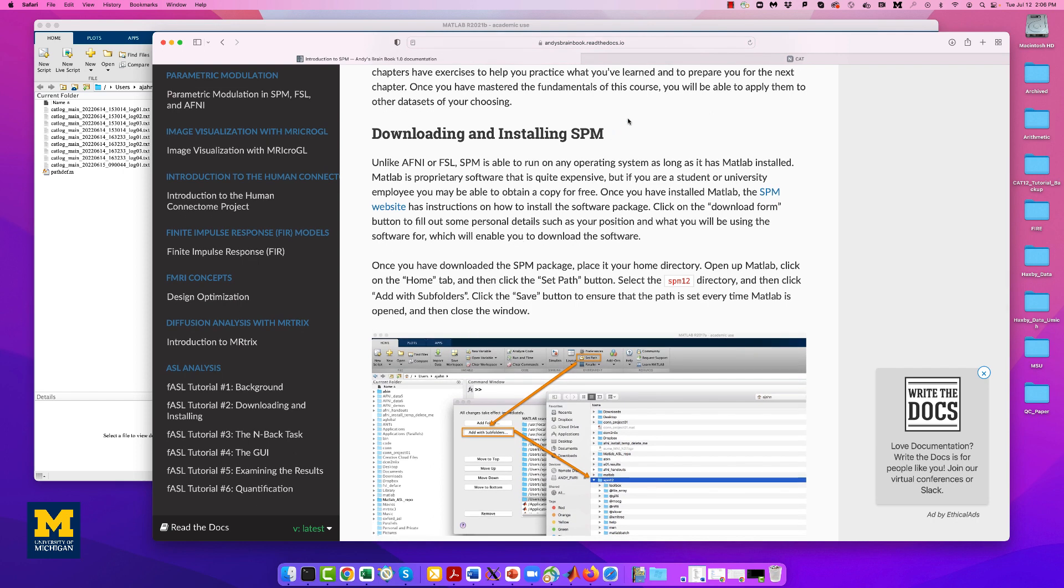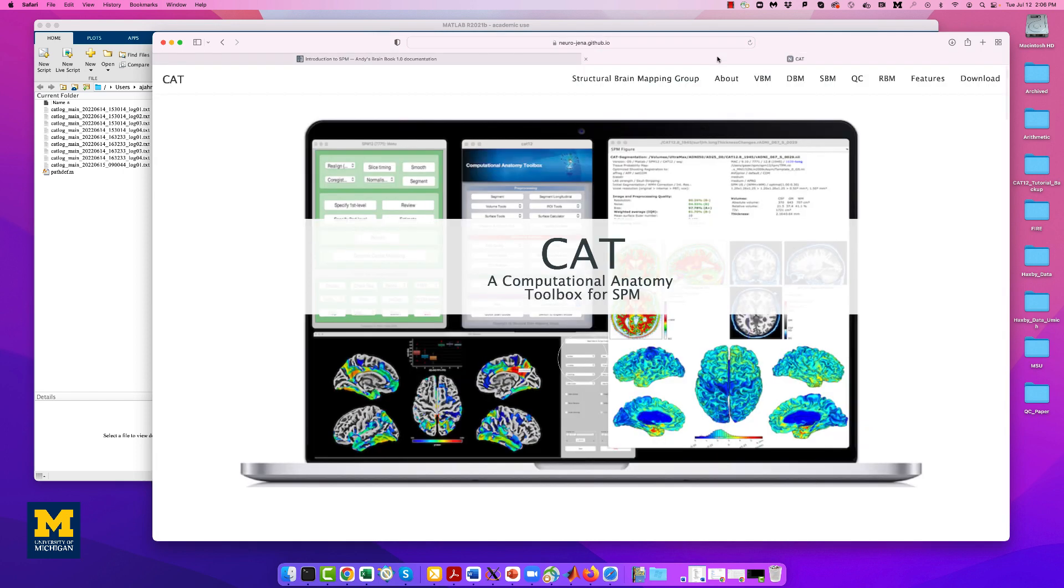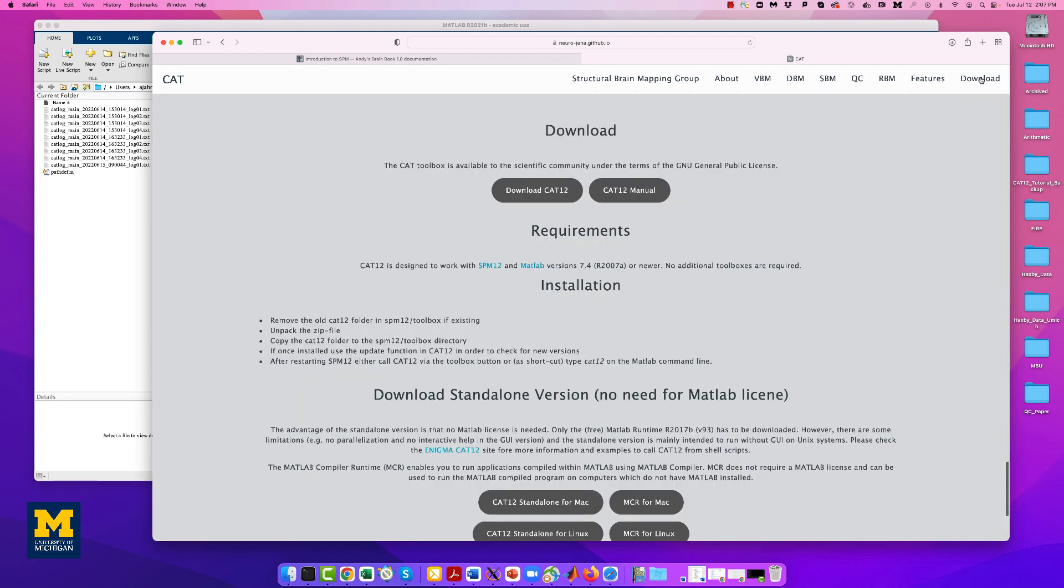Once you have installed SPM-12, the CAT-12 toolbox can be found on this link. Click on the download button and then download CAT-12, which will start the download. This will take some time, and I'm going to come back when it finishes.